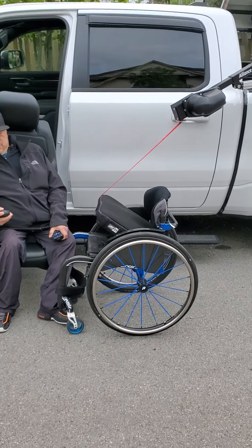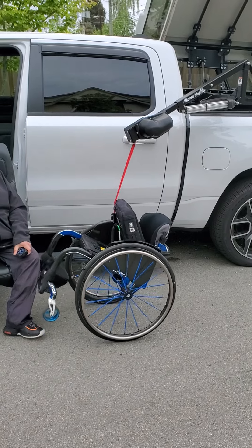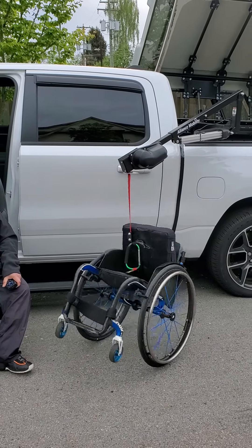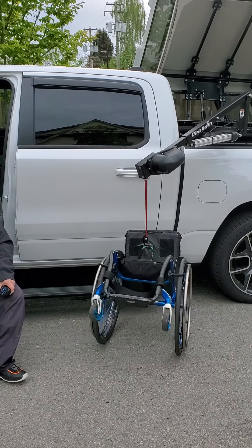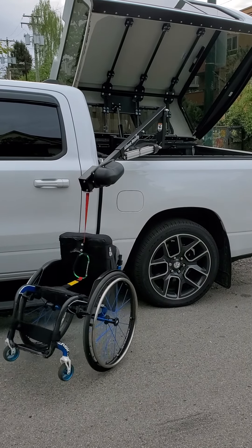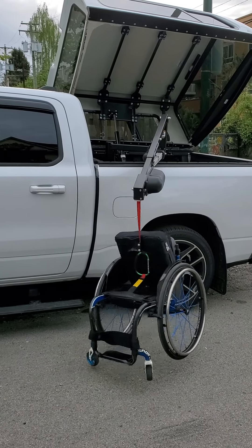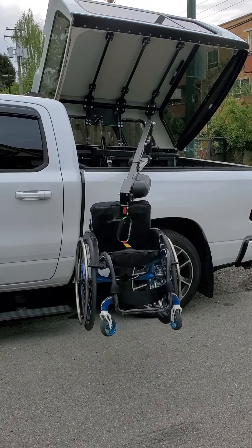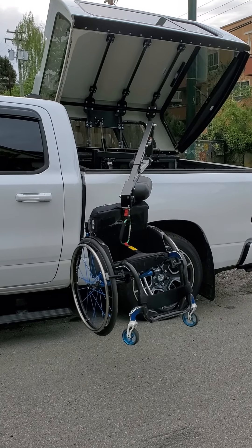Once it's on the strap, I raise the strap up a bit. I move the arm a bit more out so that it's away from the truck. I pull the strap all the way up — nice and tight in there. Then I lift the arm all the way up.